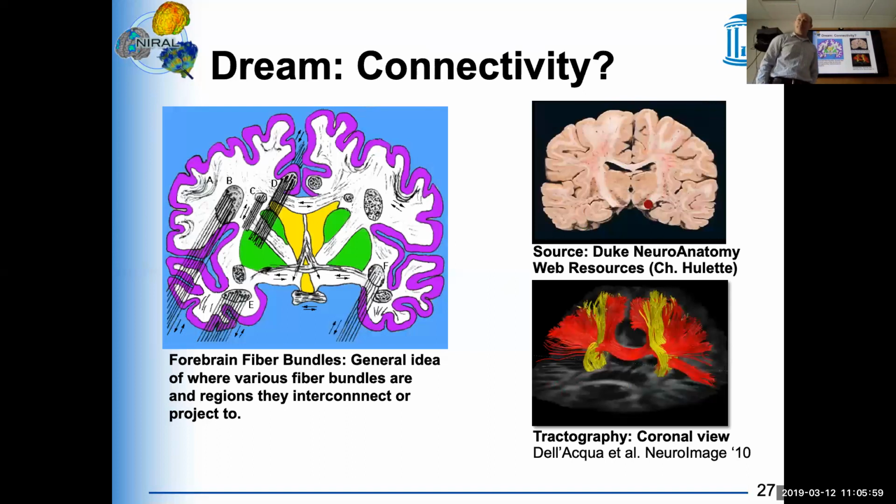How long does the 42 diffusion gradient protocol take? Well, we did that on the TIM Trio, and if I remember correctly, it was around 8 minutes. But that b-value that I mentioned at the beginning, it captures diffusion time and gradient strength. So now on the Prisma, we have double the gradient strength.